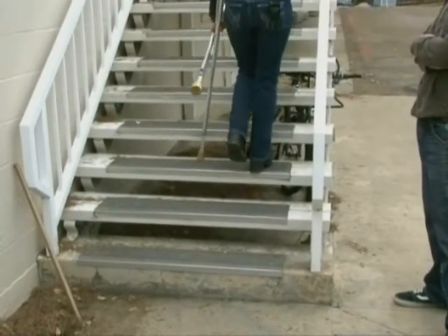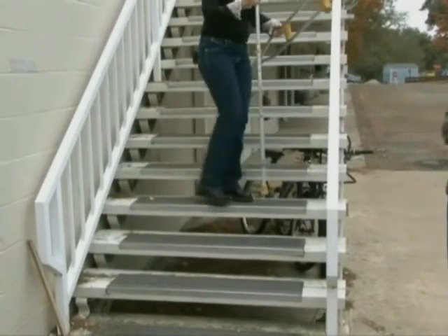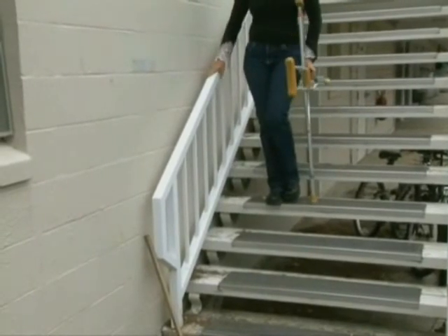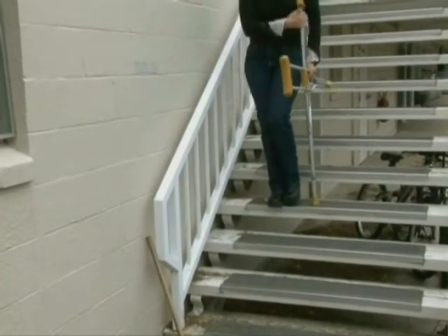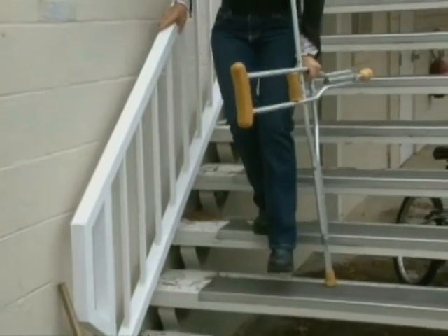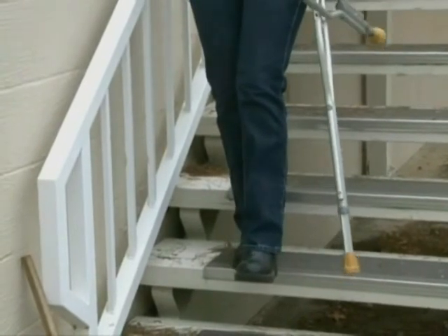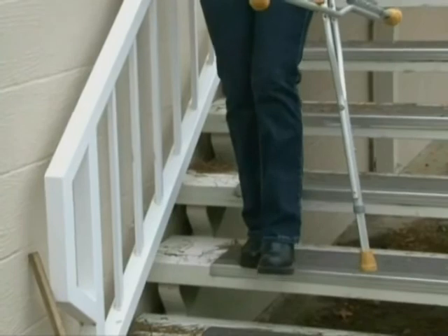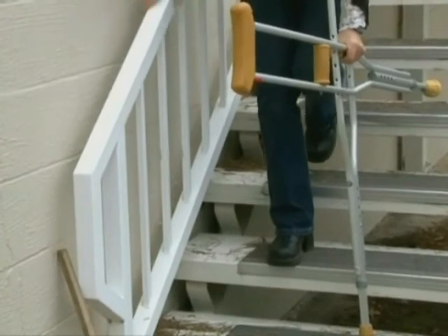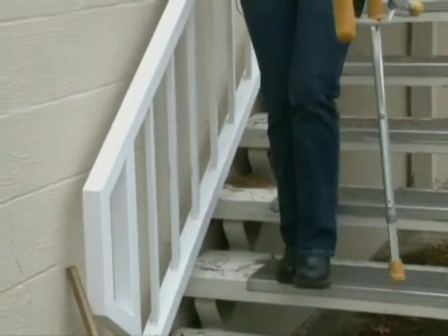Piece of cake. Going downstairs — you're going to go to the opposite side because your strong leg still needs to be on the handrail, with the weak side supported by the crutches. The bad leg and the crutches go down together, with the strong leg coming to meet it. Try to get your foot out so your weight is right down your center — if you put your leg back and lean forward your center of gravity shifts to your head and you could fall on your face.